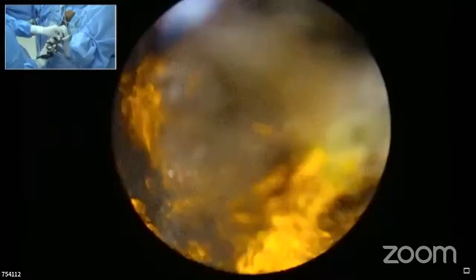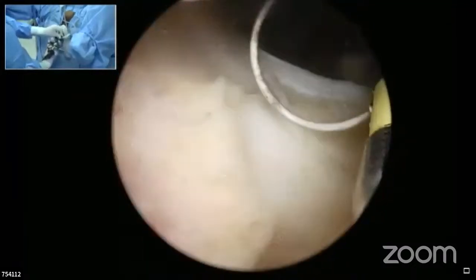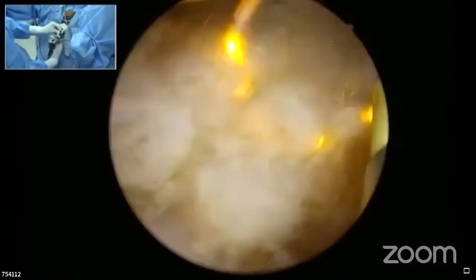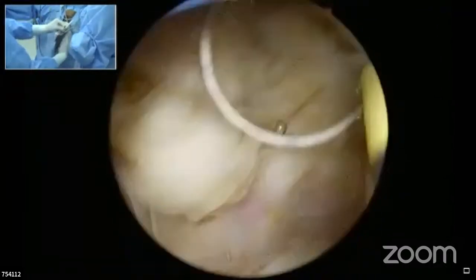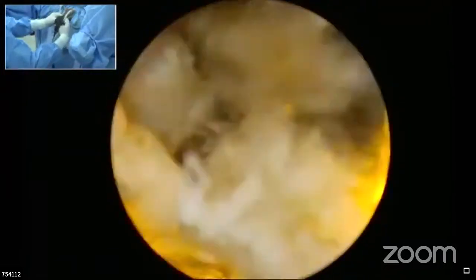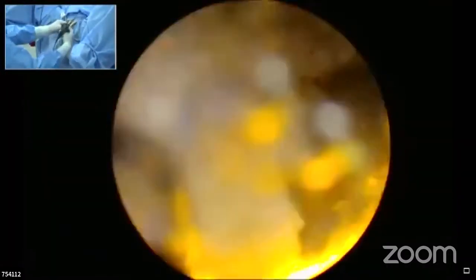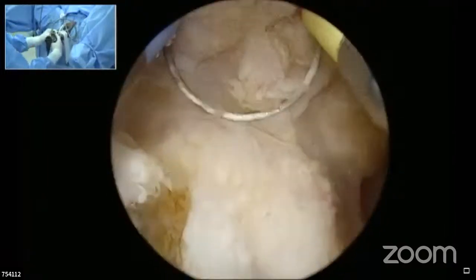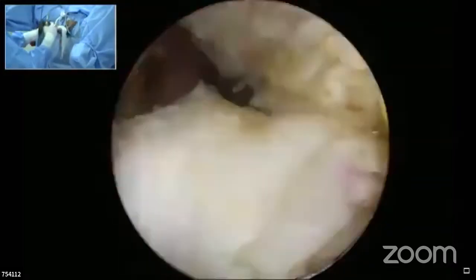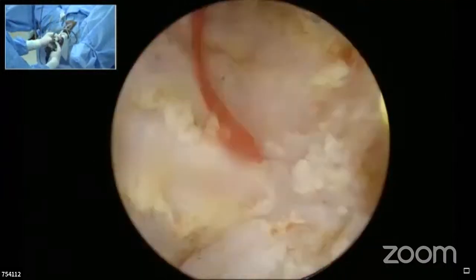Sir, but basically what happened is, are you able to hear me, sir? Yeah, I am able to hear you. So basically what happened is we evolved a bipolar enucleation technique, wherein we enucleate everything, keep it to the verumontanum and then start resecting it. But unfortunately what happened is many people are not able to adopt that bipolar thing, sir. So they are more familiar and it is easier. So to clone people, this was easy. In fact, Taib has adopted that very well and he resects very fast. So he adopted the technique of that bipolar enucleation along with resection in situ, even before it is completely enucleated. So that's how it evolved.